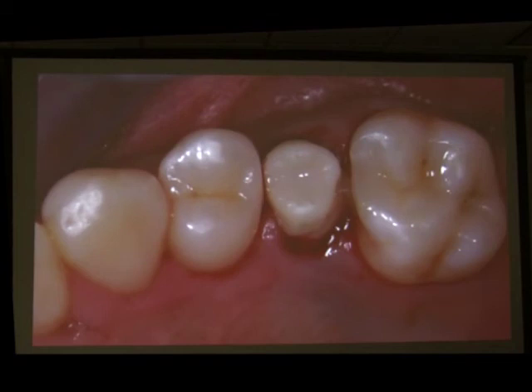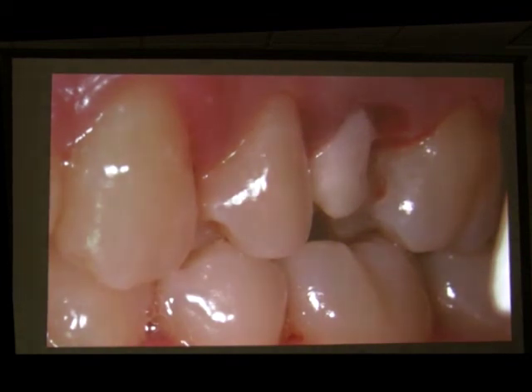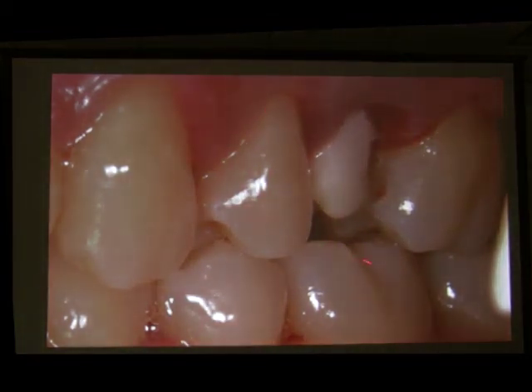Sometimes the coping doesn't fit because of the shape of the coping, and we just take out the coping from the mouth and we start prepping the coping until the coping sits. Because it's made of zirconia, if it's a contact point made of zirconia, it's even much better than if it's porcelain. So this is the type of situation, day of surgery. If the coping doesn't fit because there's no space occlusally, we prep the shape of the coping until we have enough space for the porcelain.